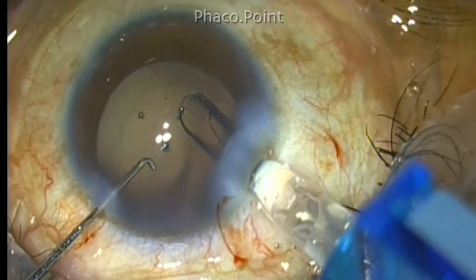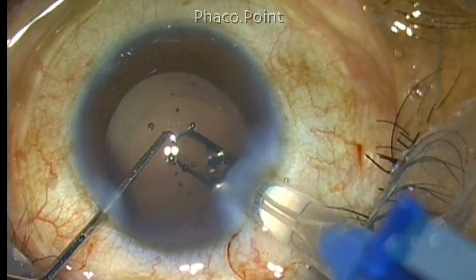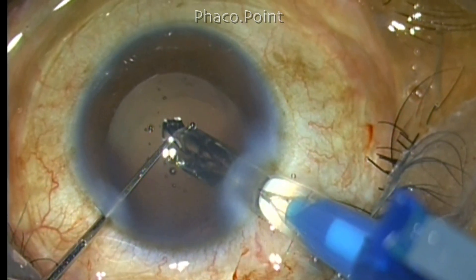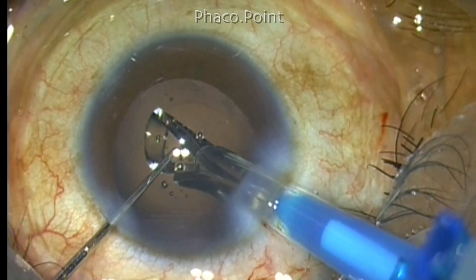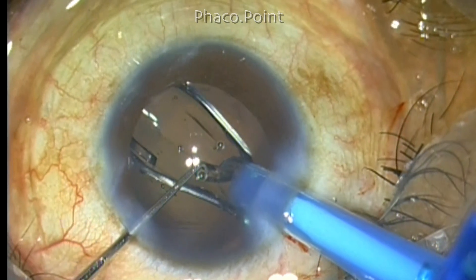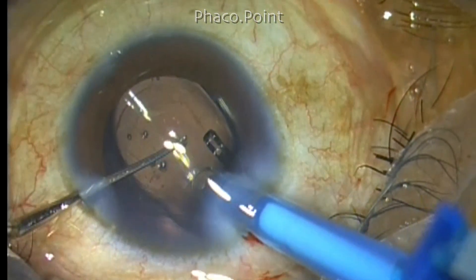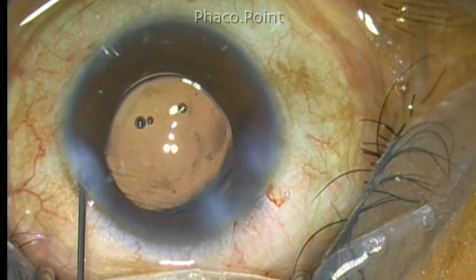The intraocular lens is then implanted directly into the capsular bag. This was a hydrophobic acrylic lens that is being injected through a narrow cartridge and there was a lot of resistance during injection. So you have to be very careful to gently release the intraocular lens by giving gentle pressure with the plunger. Once the entire lens is released, you can tuck it into the capsular bag. So the completion of the case under topical anesthesia in a hypermature intumescent cataract is over.